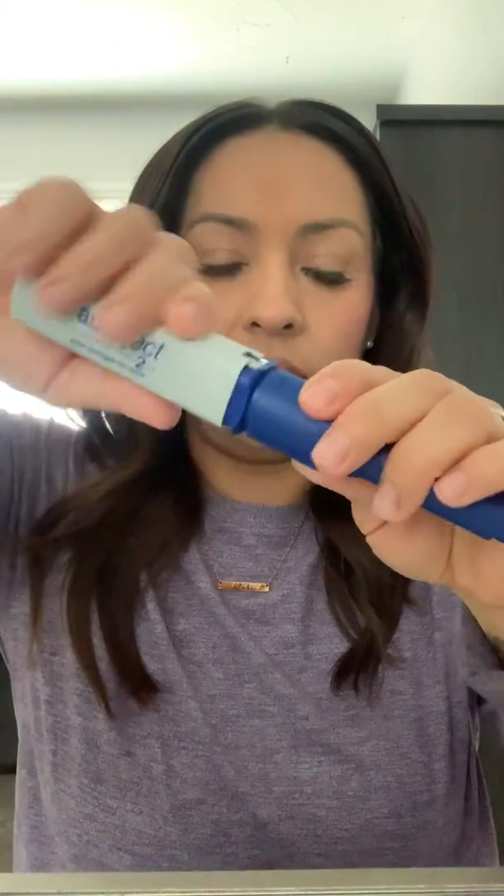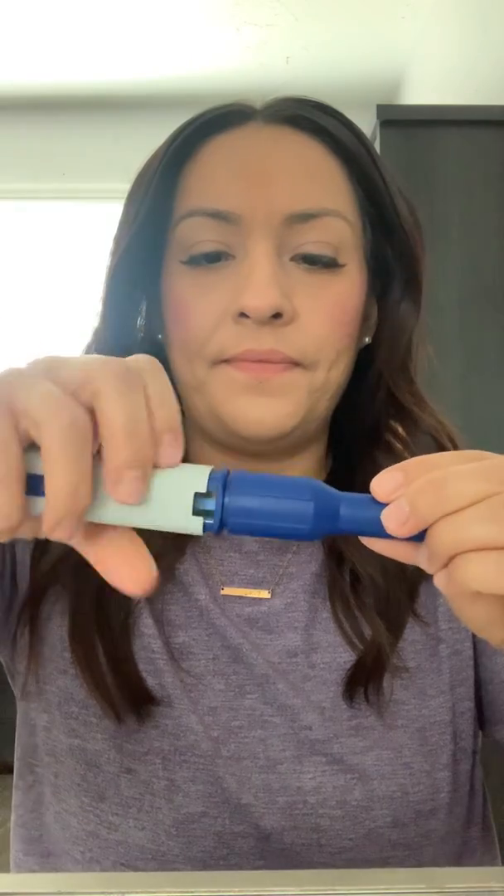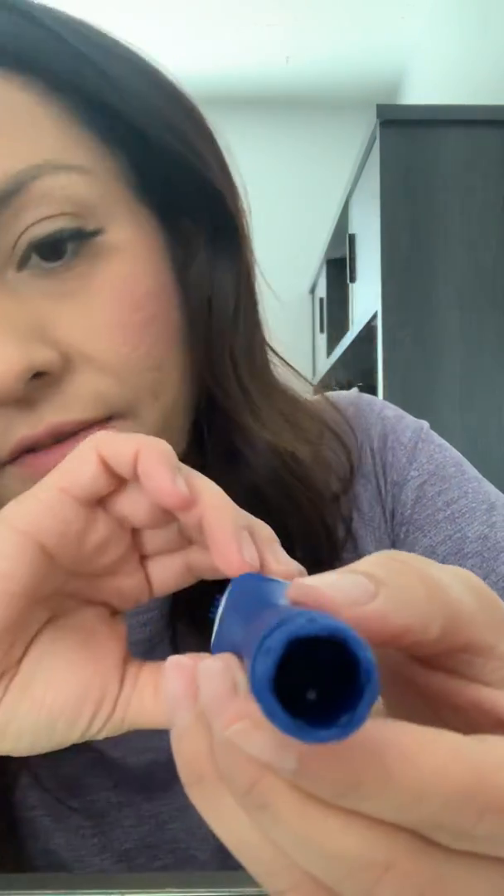And then you put the lid back on. Now you take this off — okay, all right, so that did it for me. There's the lid, it just popped off. So now this is all loaded, and you can see that's where it's going to push through. I don't know if you can see the needle in there — it's ready to go.